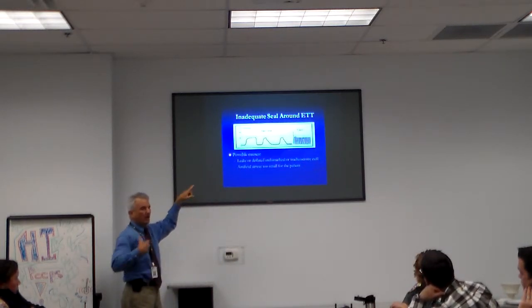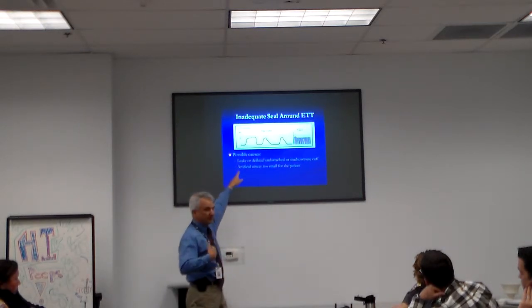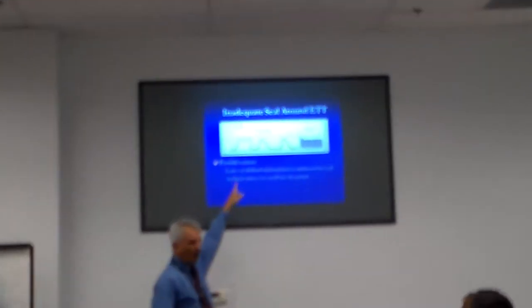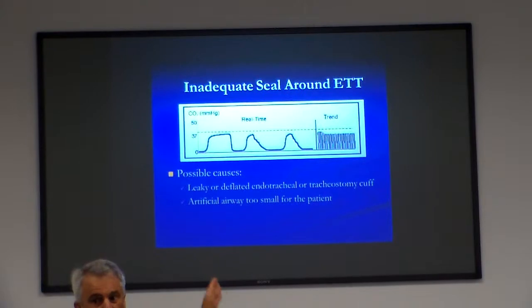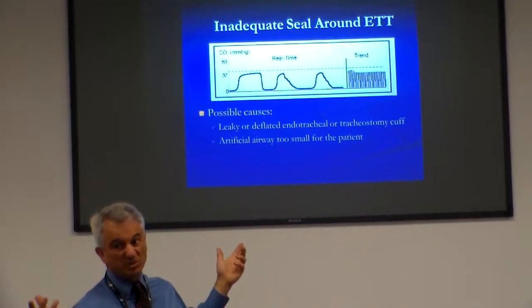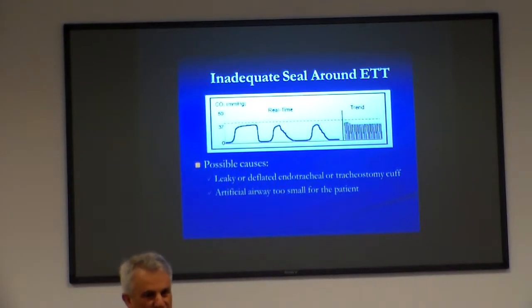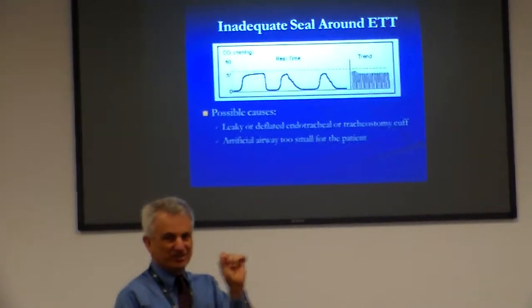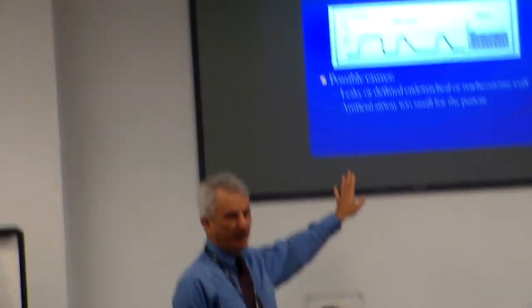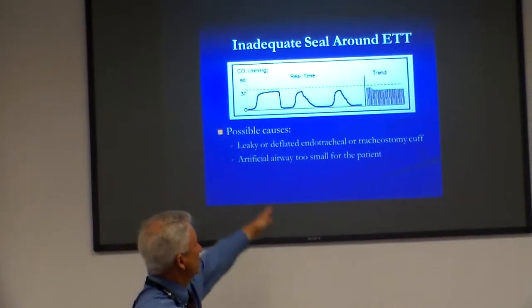As you exhale, you get the air out pretty quickly, and it's continuous across the top there, showing how much CO2 is coming out. And then the second you take that breath in, boom, it just drops, because now we're sucking in outside air. And in the normal atmosphere, there's just no CO2. We talk about global warming being from CO2, but it's minuscule little changes in the amount of CO2 that affect global warming. So there's almost no measurable CO2 in the air by our capnography. So the minute you breathe in, boom, it plummets.